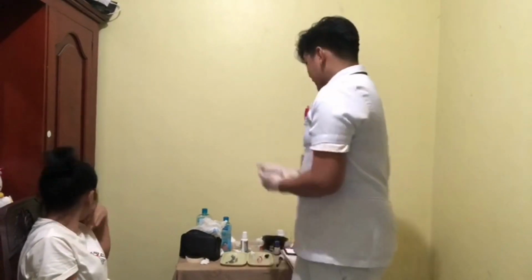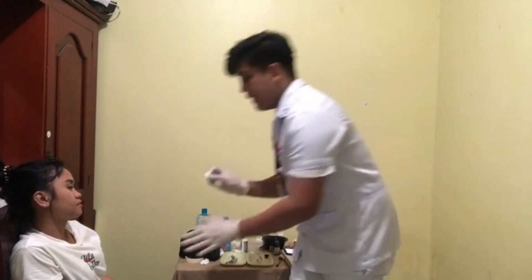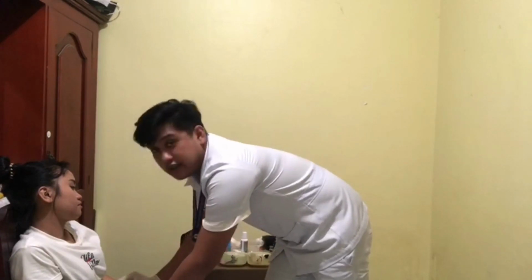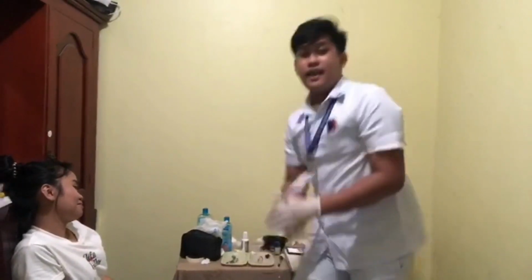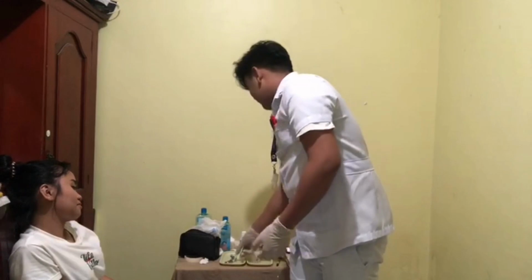Now we'll wear our gloves, since I already wear gloves. Now I am going to clean first with the cotton balls on the abdomen, in a circular motion, and then discard. After that, remove the needle cap by pulling straight off.